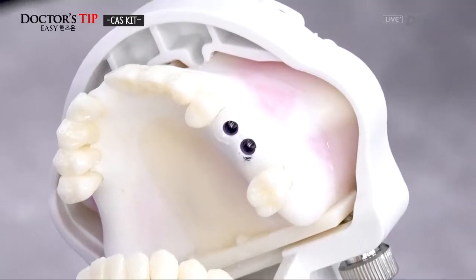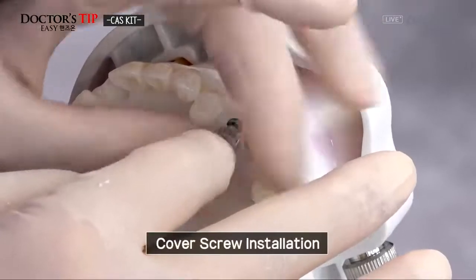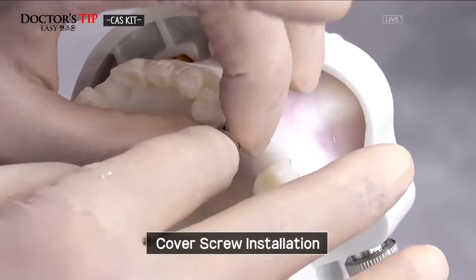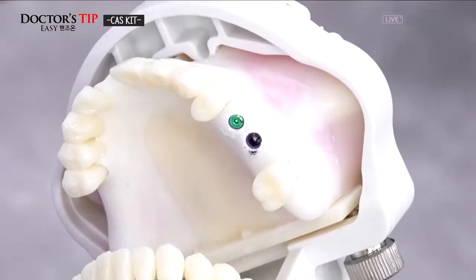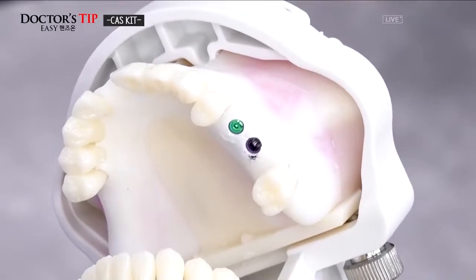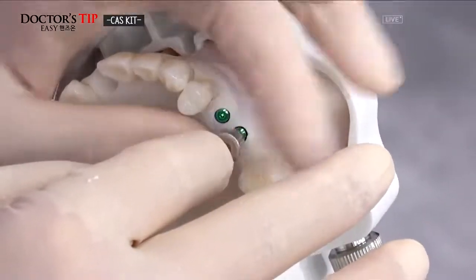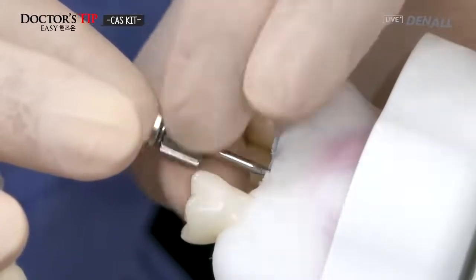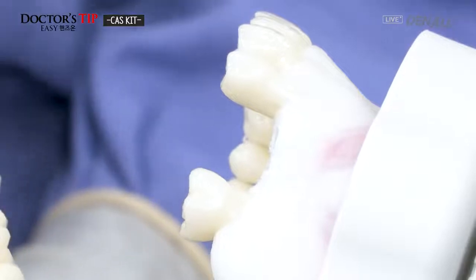During surgery, a healing or cover screw can be used. TS3 implants are placed deep enough, 1 millimeter below the inferior bone level. Now the surgery is finished.